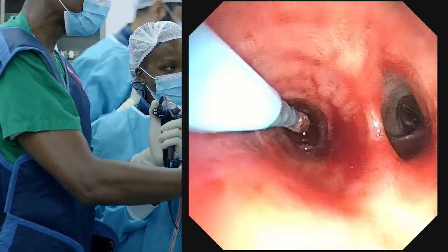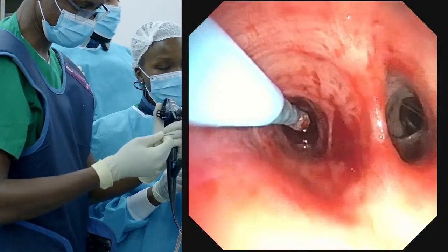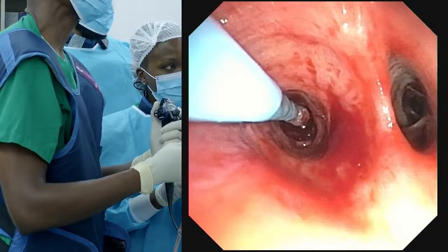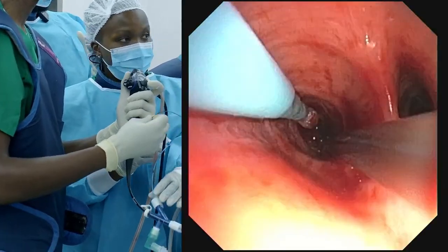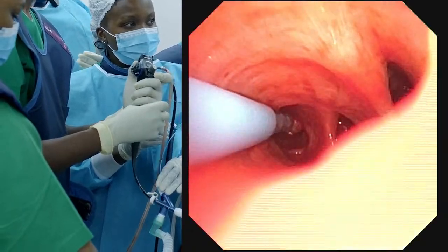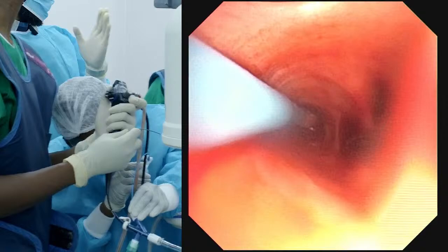How many have you got? 5. Okay, we can take one more. 6 is the maximum we should take. I've understood what you meant with the continuous cryo. The fluoro. Jackie, you see your balloon is perfect. That's how it's supposed to be. You can pick your segment. If you can get the side one, well and good. Now fluoro. As soon as it's out, you can't see the tip. It has to be fluoro.